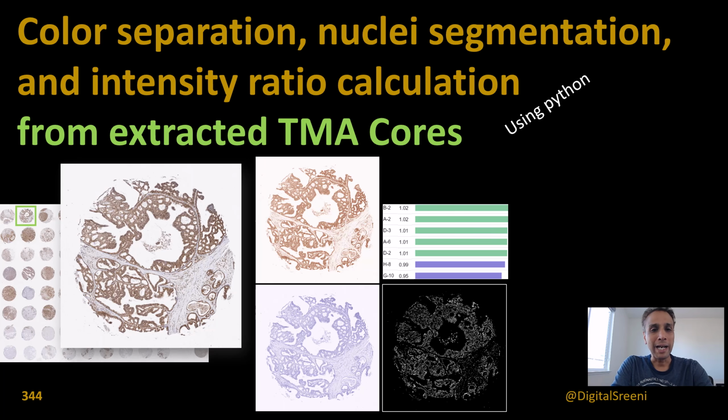Hi everyone, welcome back. I hope you watched the last video on the topic of extracting TMA cores from a tissue microarray. If not, I highly recommend going back and watching it. And in this one, of course, I'll do a crash course of what we did in the last video, but it definitely helps if you watch the last one.